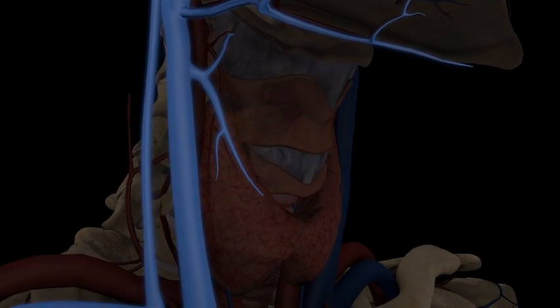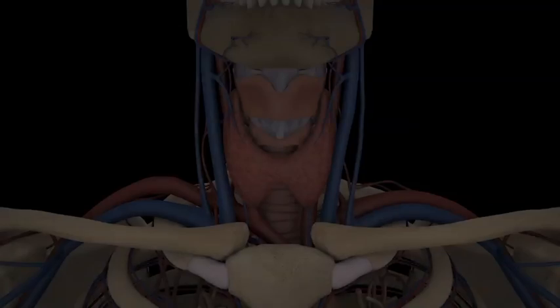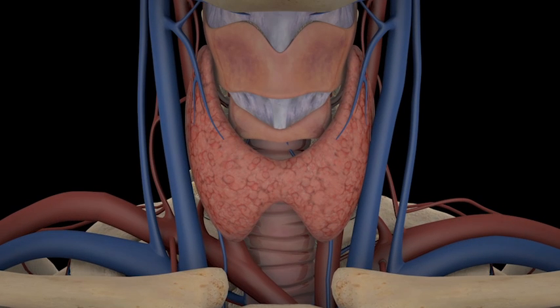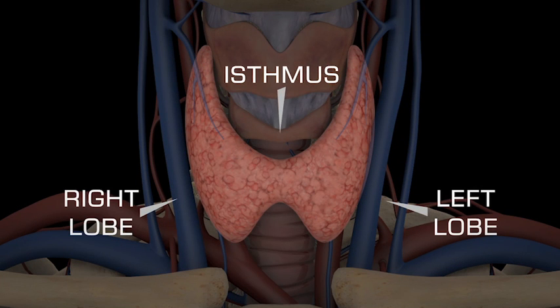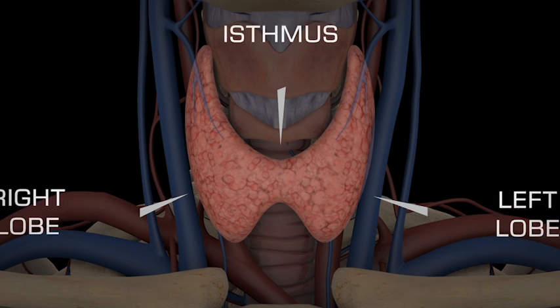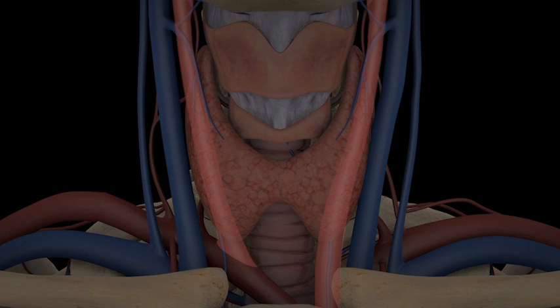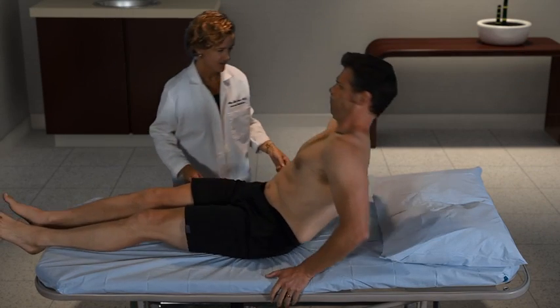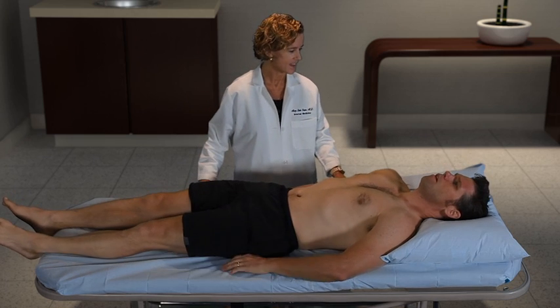The internal jugular vein descends to the level of the first thoracic vertebra. The thyroid gland consists of two lobes — the left and right lobes — which are connected by the isthmus. The isthmus lies anterior to the trachea. Note the relationship of the common carotid artery with the lateral aspect of the thyroid.